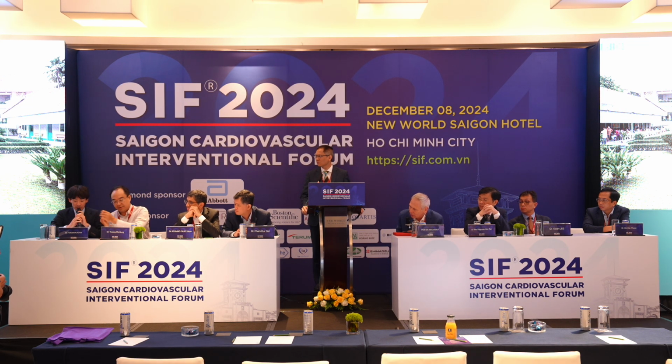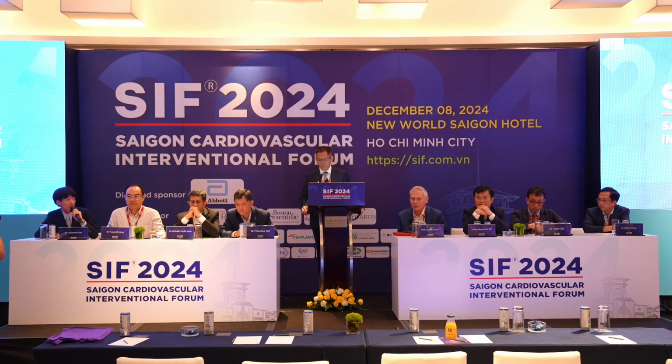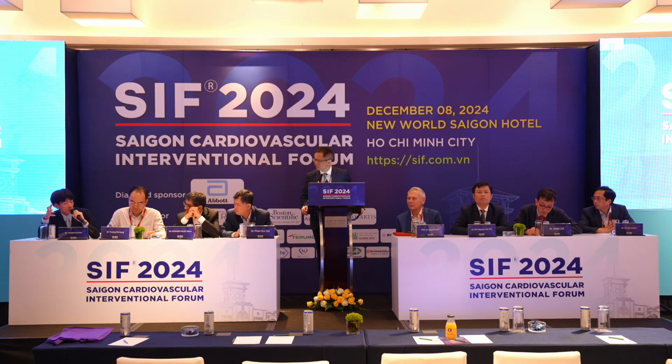It's on. Yeah, thank you. Thank you for a nice presentation. So the large volume of thrombus is our enemy. So right now in Japan, we use a perfusion balloon for such lesions. I don't know if you have a perfusion balloon here, but we used to use a perfusion balloon just for bailout for rupture or perforation.